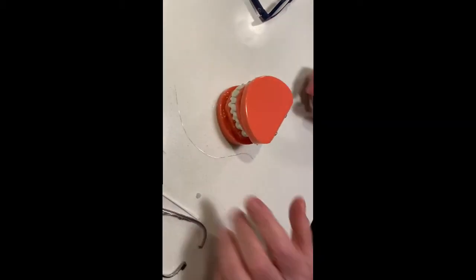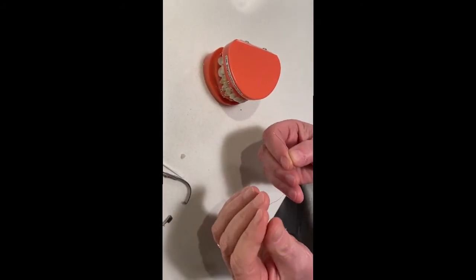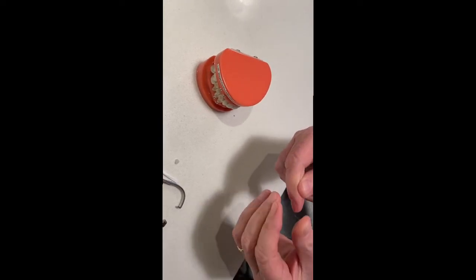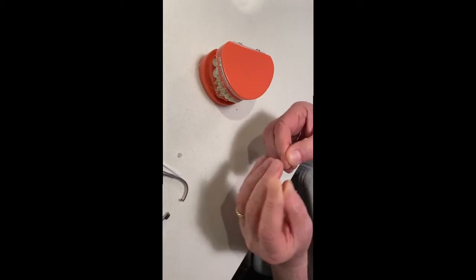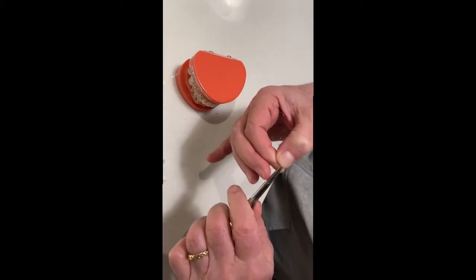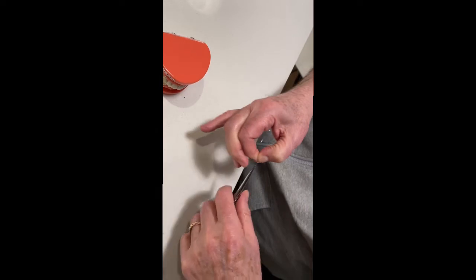So you start with a piece that's about 6 inches long. You fold it in half. You bring the ends together with your twisting instrument. You make a nice tight tail with about 20 turns. And this is the piece.